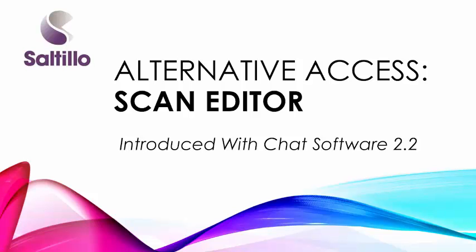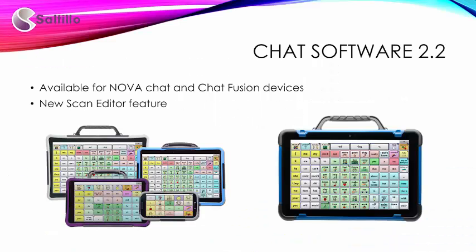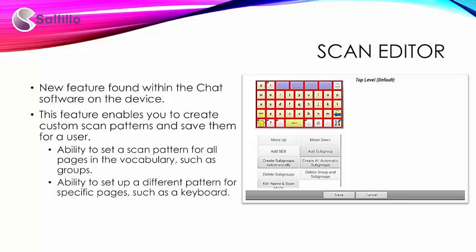This tutorial will explore a new feature, the scan editor, found with version 2.2 and higher of the chat software. The chat software is found on the Satilo NovaChat and ChatFusion devices. The scan editor is located within the chat software on the devices. There may be times when the standard scan pattern may not be optimal for the client. This scan editor feature enables you to create custom scan patterns and save them for a user.